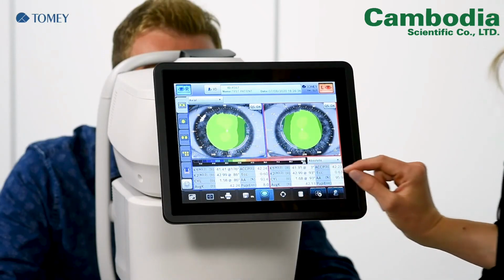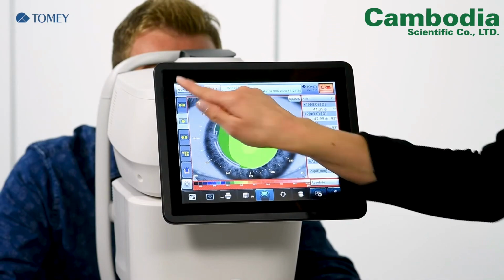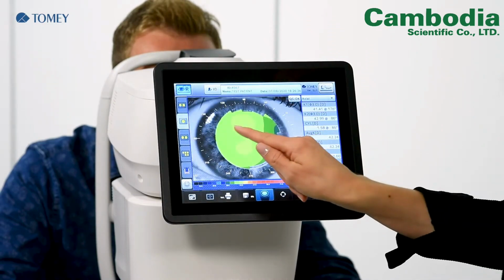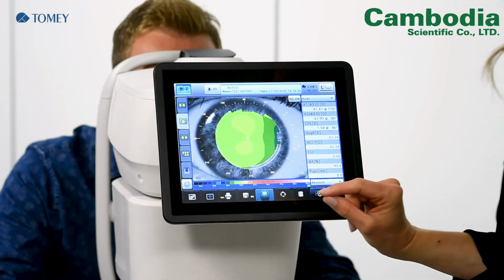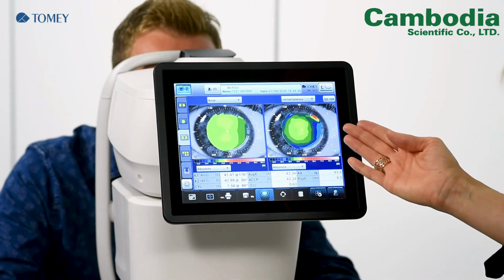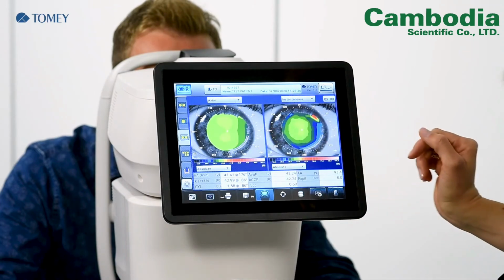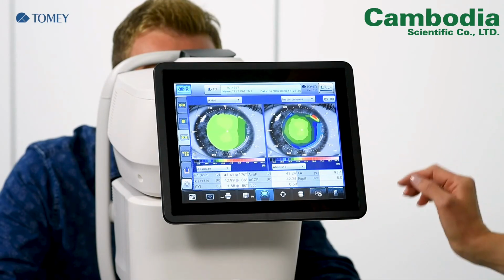The next map is a single map where you can see either the left eye or the right eye in a bigger screen this time. And then we have also the possibility to compare different map types on the same eye. So this is the right eye, and we have one time the axial map and one time instantaneous.